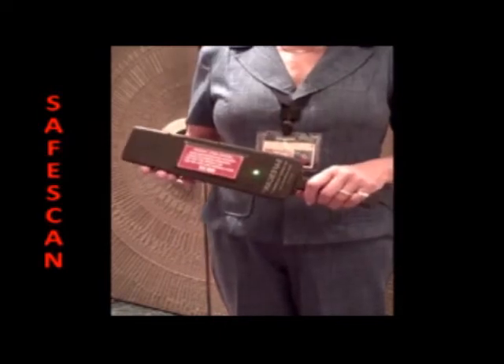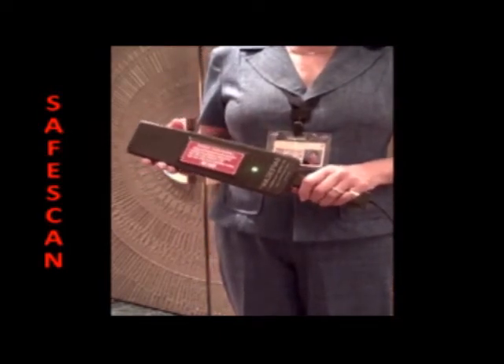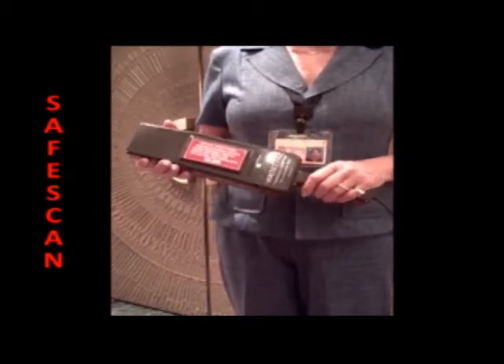In several demonstrations, Dr. Emanuel Canal has demonstrated that a single staple can be found. The effective range of the target scanner for finding such a tiny ferromagnetic threat is approximately one-half inch.